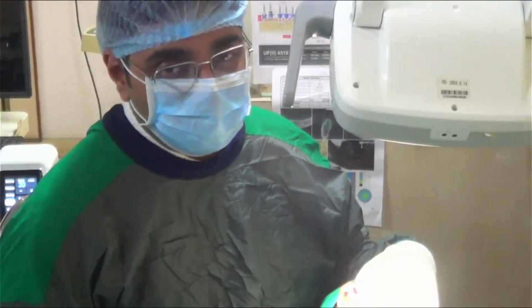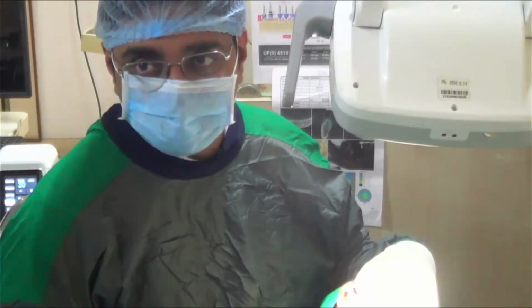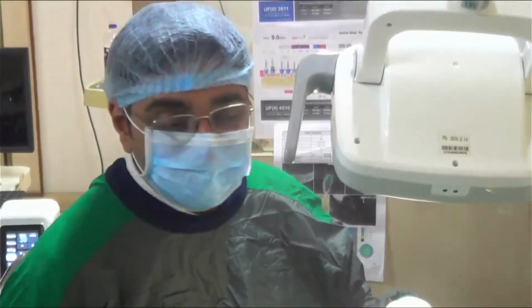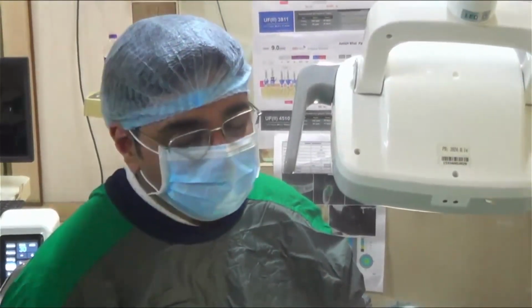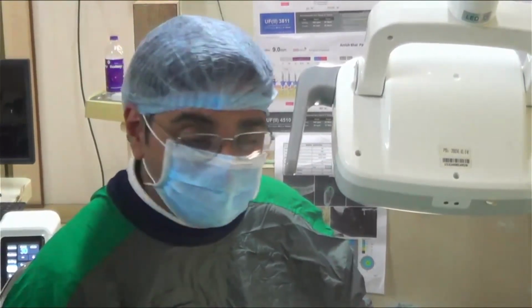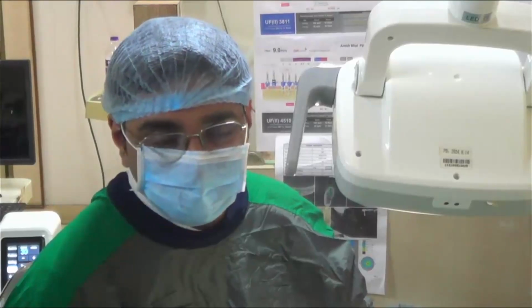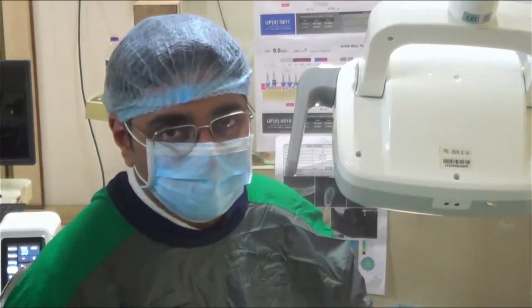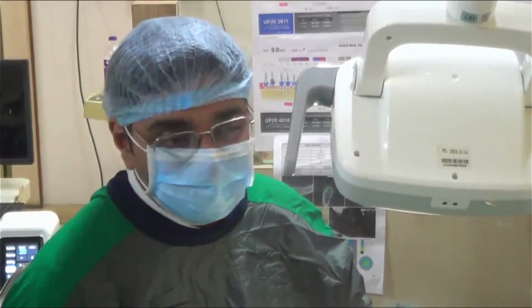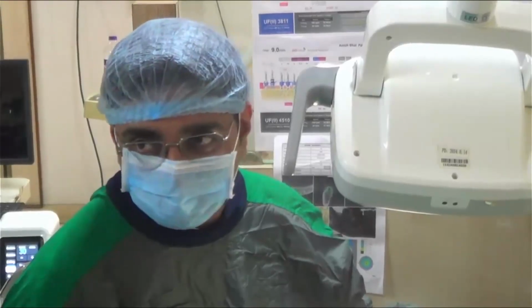So you saw how seamlessly the guide was fitting and how easily we are just doing the drilling. It does not mean that we are doing a blind surgery. You have to analyze your plan and then drill according to the technique. So it's a different science altogether as compared to your conventional one. And if you want to grow in implantology, you have to become master of both.